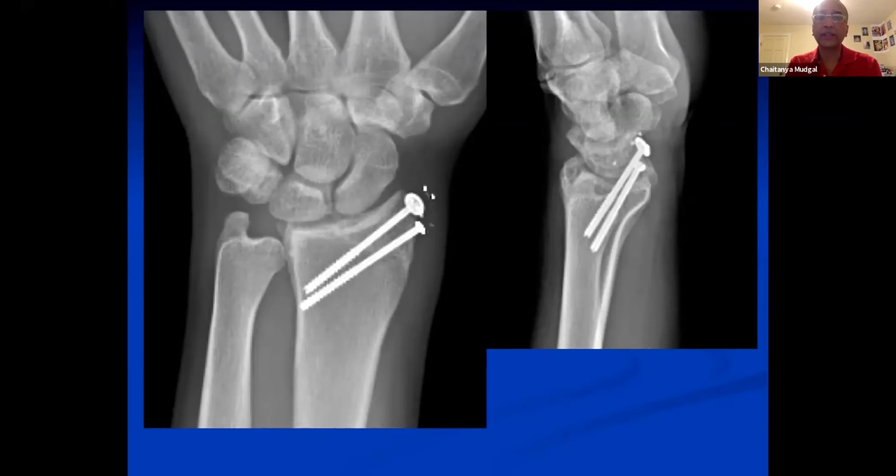You can see some debris generated by the screws. A point to clarify: the first compartment is right there, so you go slightly volar to it. You usually have to start volar and aim dorsally and ulnarly so that you're slightly volar to the first compartment. Not surprisingly, since he's a hockey player and these screws were in the area responsible for his slap shot, they did bother him. So at about six months I took them out.